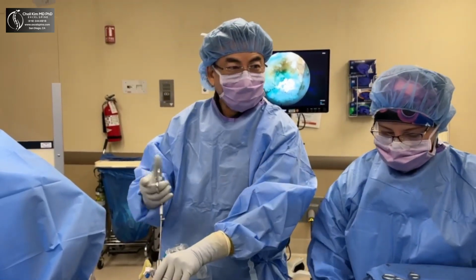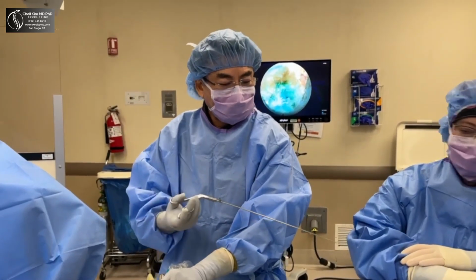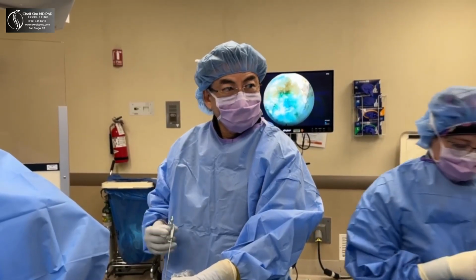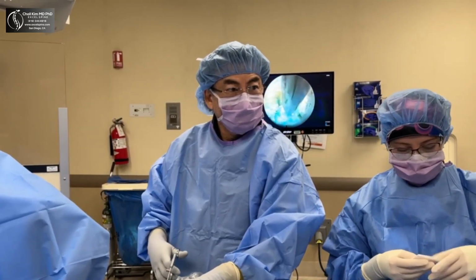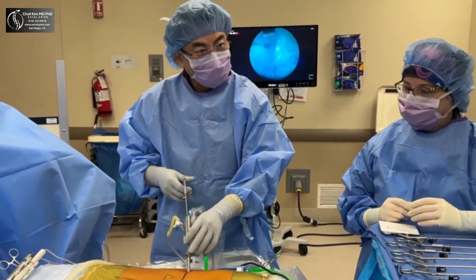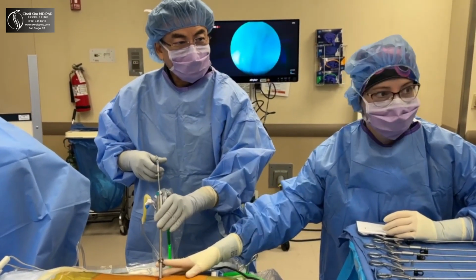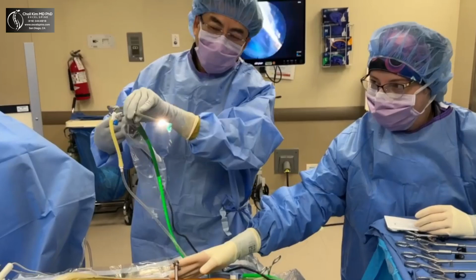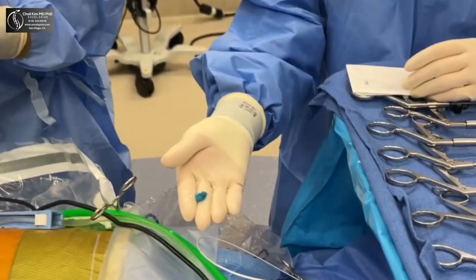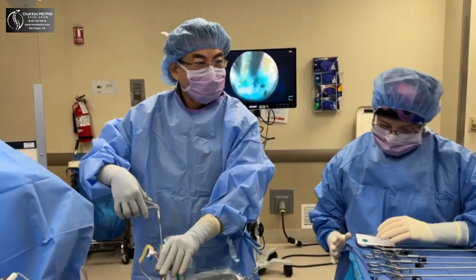Let's see if this piece is going to want to come out on its own, or is it going to be like my punk teenage kids? Oh, look at that. Can you hold that scope? The cannula, yep. Because it will not fit down the channel. It's baby Andre. That's not even close to being the biggest disc herniation we've taken out this year, but it's respectable. Respect, as they say.